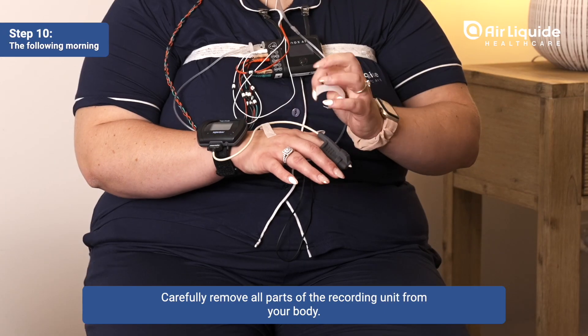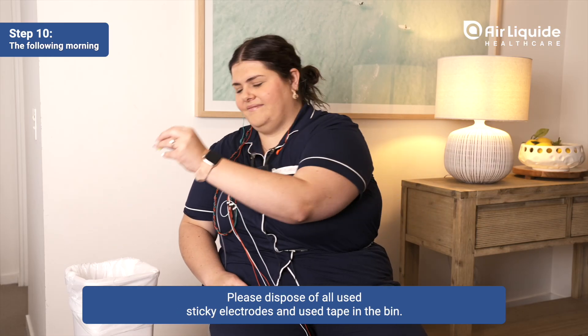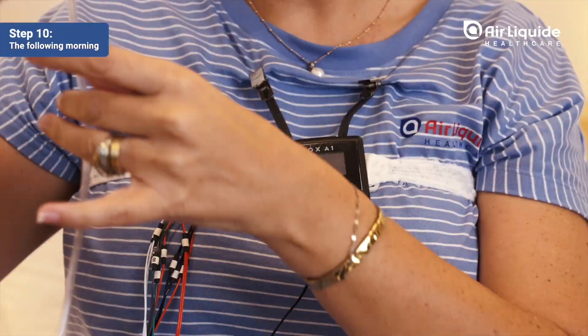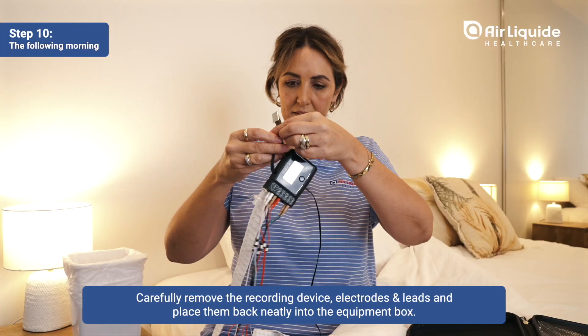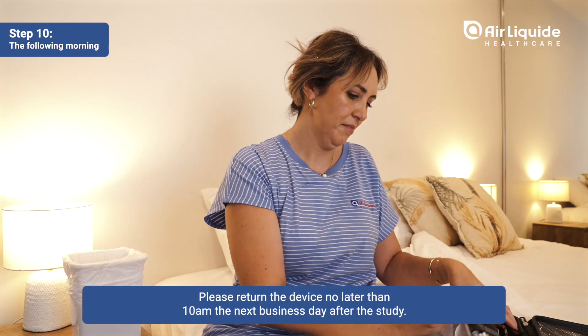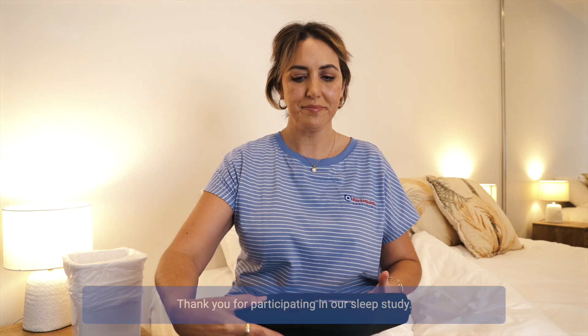Carefully remove all parts of the recording unit from your body. Please dispose of all used sticky electrodes and tape in the bin. Carefully remove the recording device, electrodes and leads, and place them back neatly into the equipment box. Please return the device no later than 10 a.m. the next business day after the study. Thank you for participating in our sleep study.